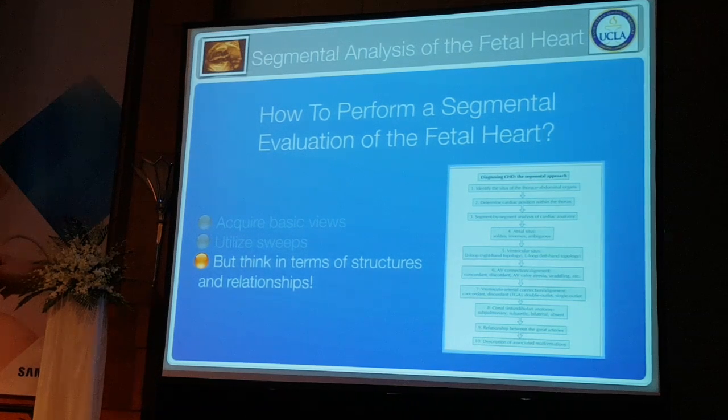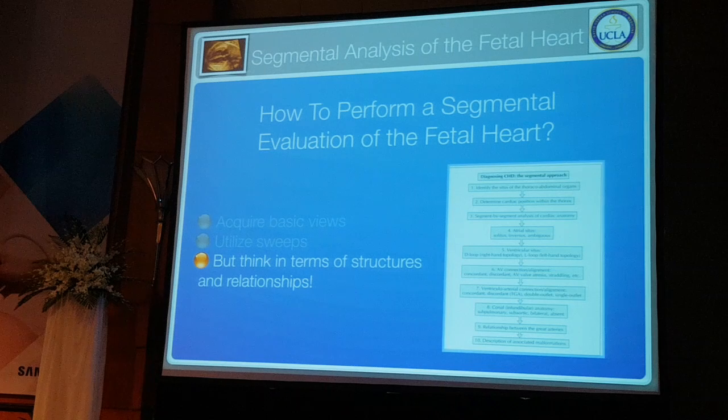So when you're doing a four-chamber view, you want to be thinking, look, am I seeing the mitral valve well? Is it normal? Is the crux normal? Is the tricuspid valve normal? Is the heart squeezing normally? So you want to think of the structures. It's not just, oh, I got a four-chamber view, I'm good.